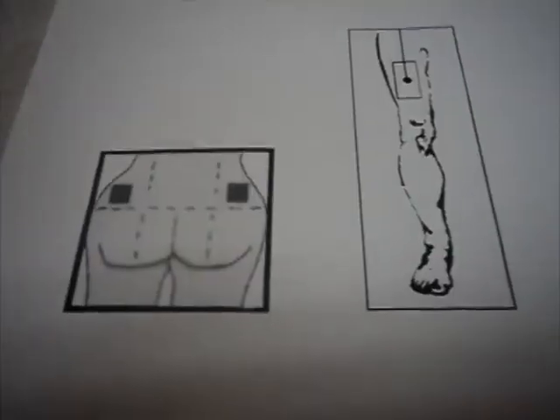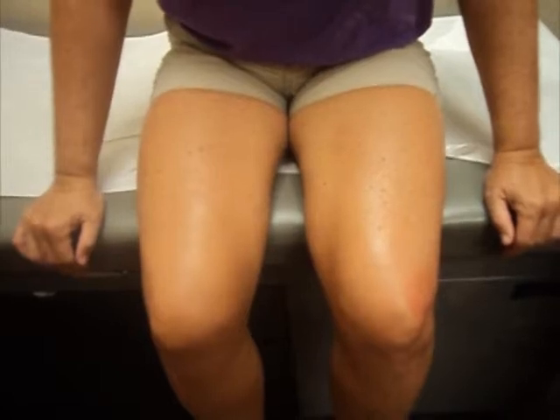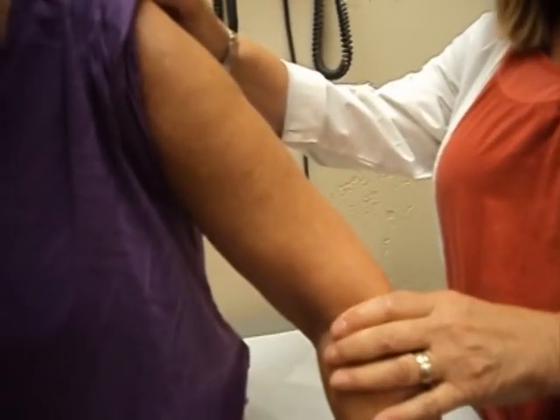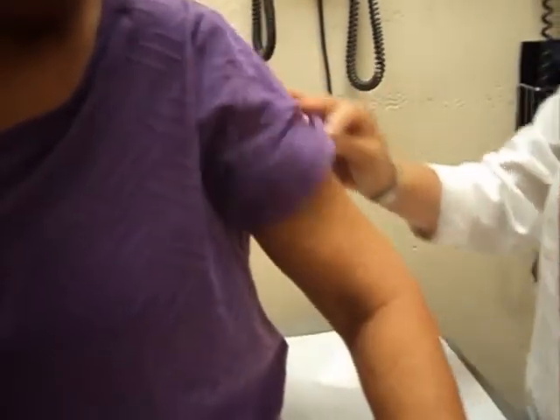There are 3 injection sites that can be used for the B12 injection. The thigh is one site, and that can be used by you if you're doing the shot to yourself, probably most easily. The other part is the upper arm, and some people can actually inject in their arm themselves, and if you're having someone help you, that's a great place to give an injection. And the third place is in the buttock, and we will demonstrate how to find the proper location to give the injection in all 3 sites.